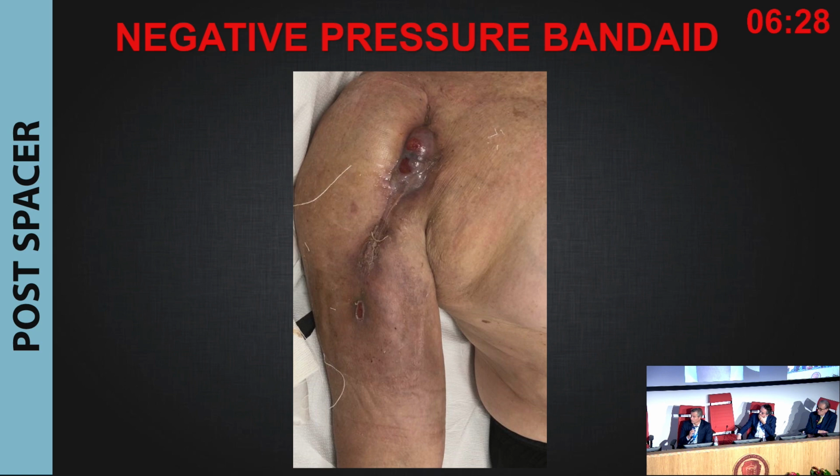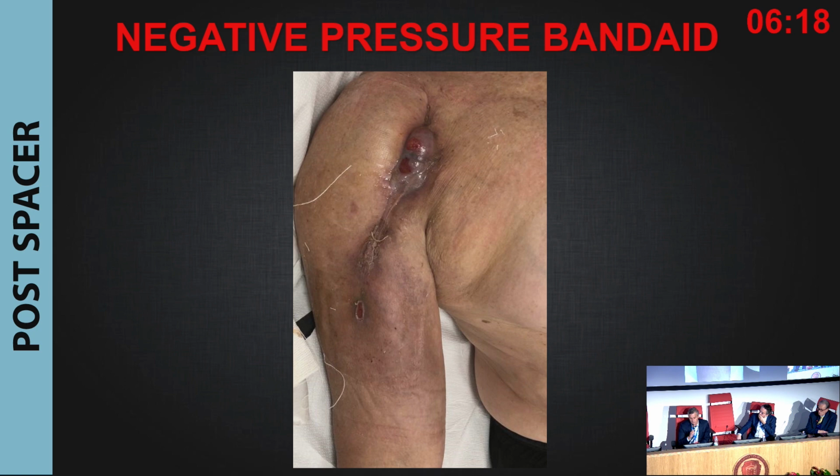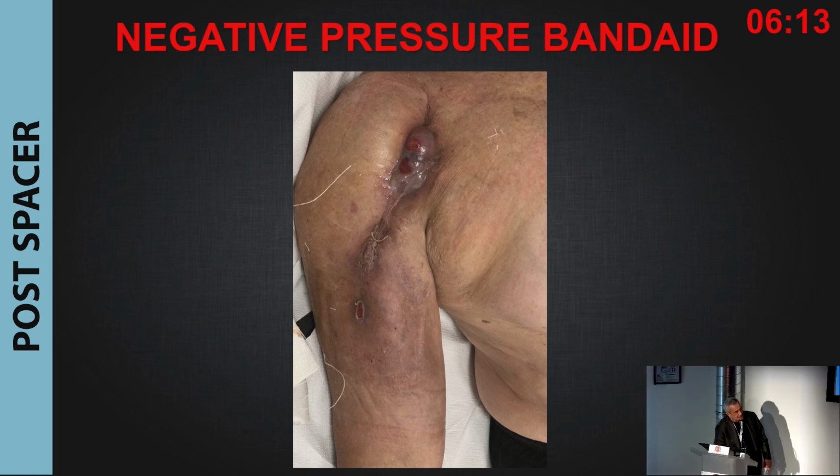So your advice is to make surgery immediately, in this case? In this case, looking at that, I would go straight into a... Yes. It's very uncommon, so... Repeat first stage. Perfect. Dr. Antuna, what is your behavior in this case?